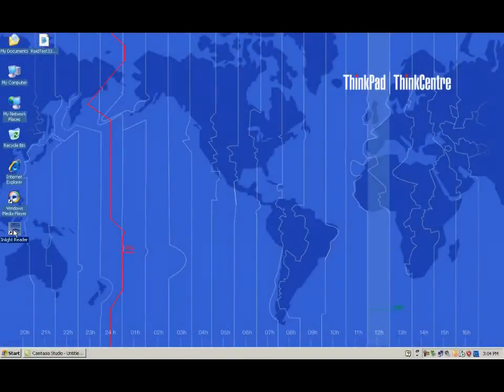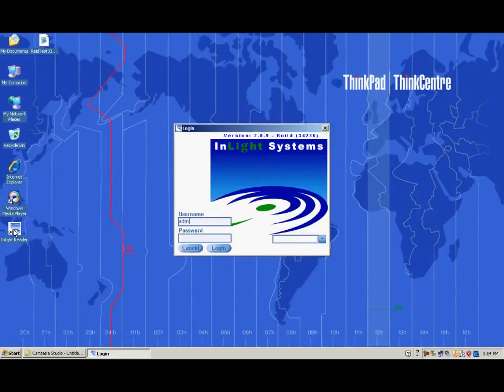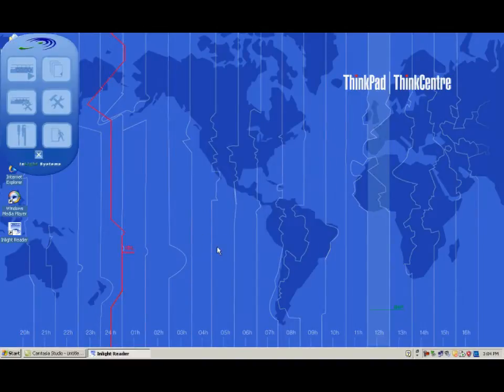To start the InLight Reader software, double-click on the icon on the computer screen desktop. On the login screen, type the username and password to gain access to the program. The menu screen will appear.